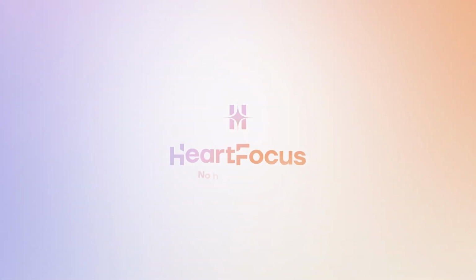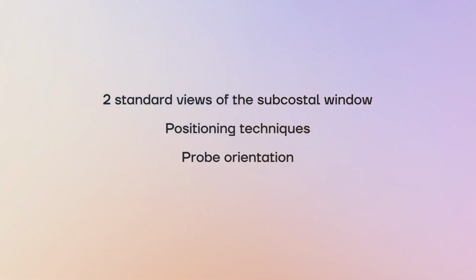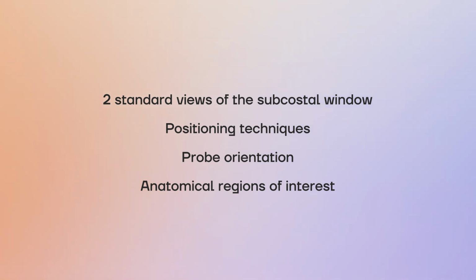Welcome! In this video, we will explore how to acquire high-quality cardiac ultrasound images for the subcostal window. We will walk through the two standard views that can be obtained from this window and cover proper positioning, probe orientation, and the anatomical regions of interest.